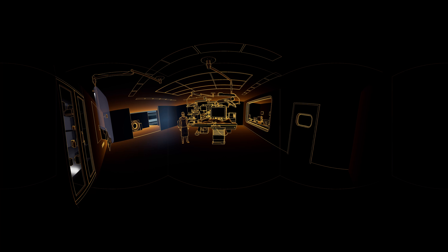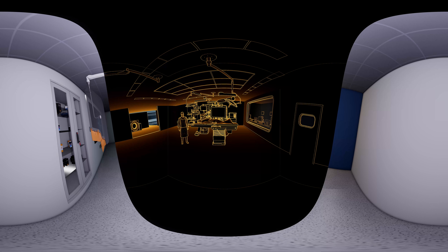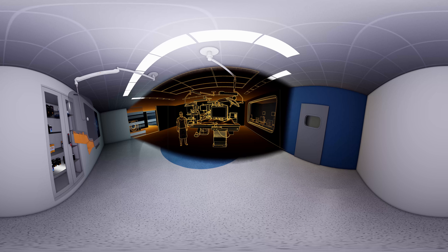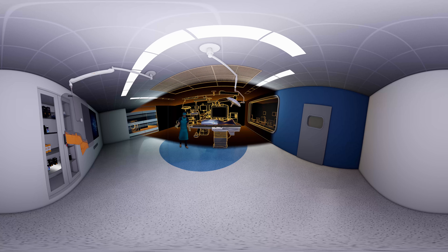Welcome to the virtual world of Mavic. Together we will experience the latest hybrid OR with the system solutions and x-ray protective equipment from Mavic. Meet Dave, your virtual assistant for today. Hello there, shall we begin?